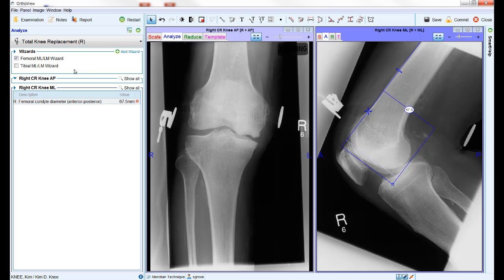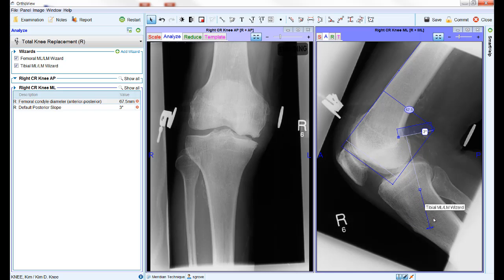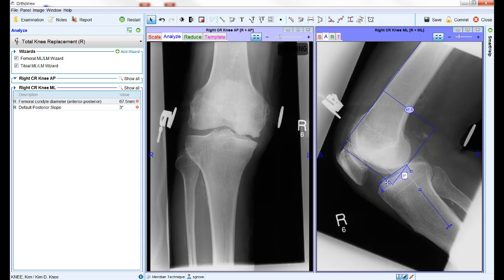To orient the tibial wizard, select either one or both of the points on the vertical line to position it parallel to the posterior edge of the tibia. Use the two points on either end of the box section of the wizard to position this so that it sits across the tibial plateau.